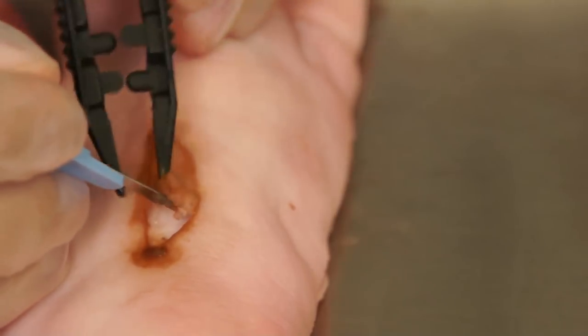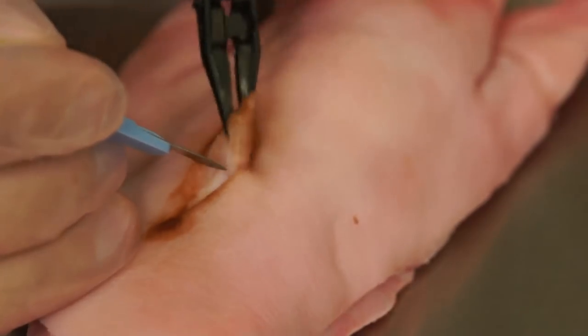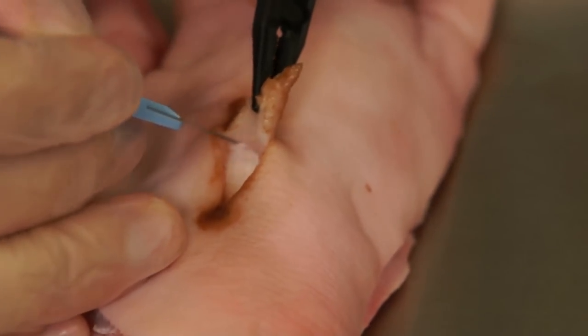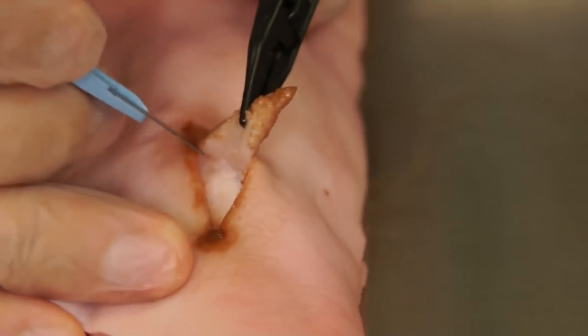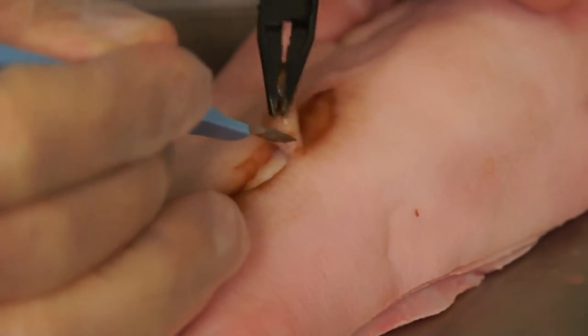It is important to identify the interface between the necrotic tissue and healthy tissue and maintain incision within this plane. As one performs the debridement, the necrotic eschar will begin to peel off, similar to how an orange peel removes from the orange fruit itself.